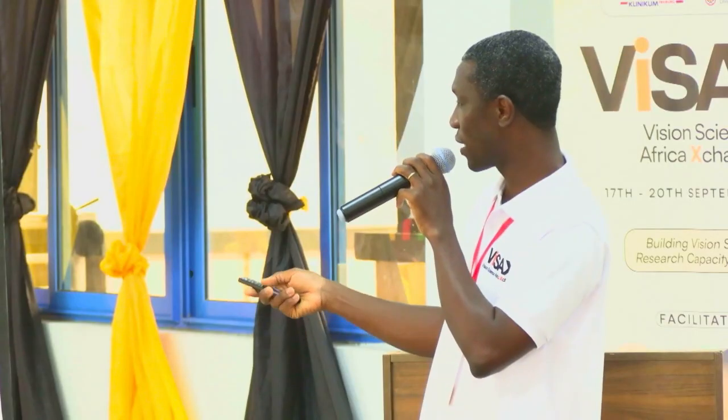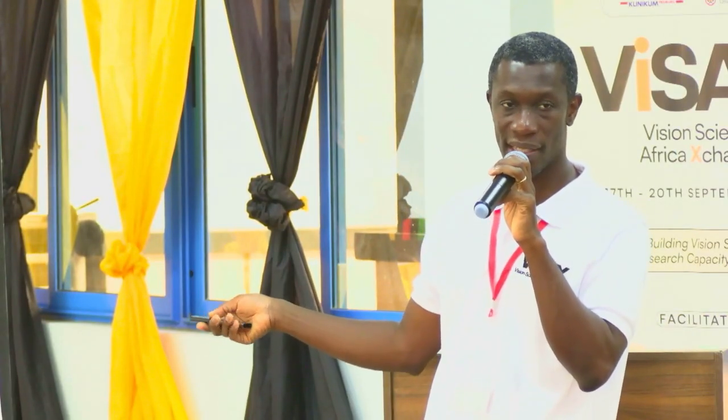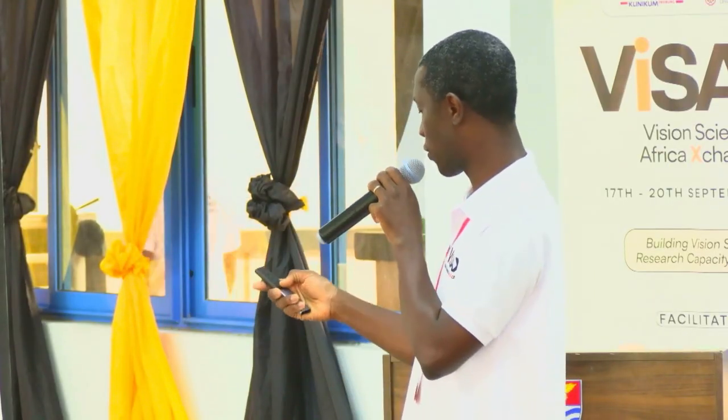All right, and usually we measure a larger area as well, around 60 degrees to about 120, depending on which size of the screen you are using. So the macula is about 20 degrees. The pattern ERG usually just has anything between 15 degrees and 20 degrees, so that it is just measuring the macular function.